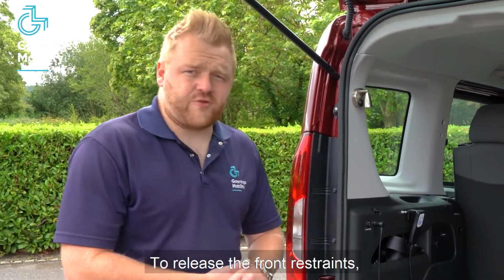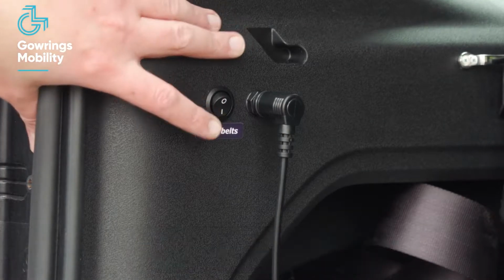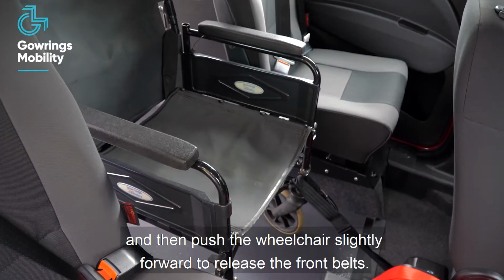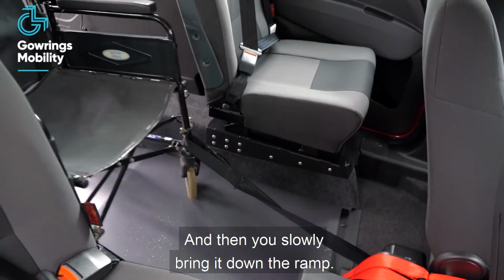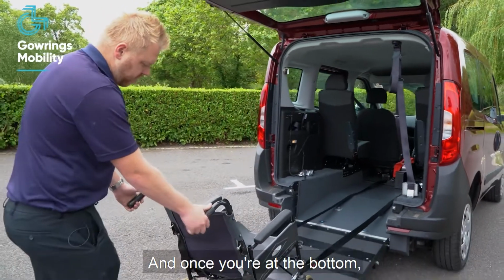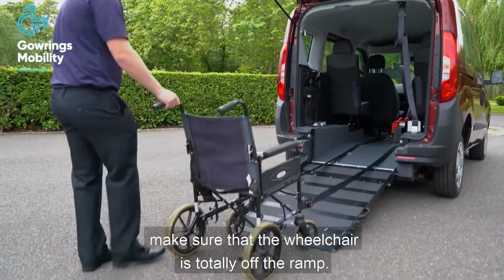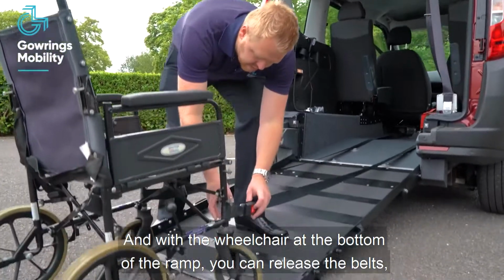So to release the front restraints, all you need to do is turn the front belts on by the switch on the side, and then push the wheelchair slightly forward to release the front belts, and then you slowly bring it down the ramp. Once you're at the bottom, make sure that the wheelchair is totally off the ramp, and with the wheelchair at the bottom of the ramp, you can release the belts.